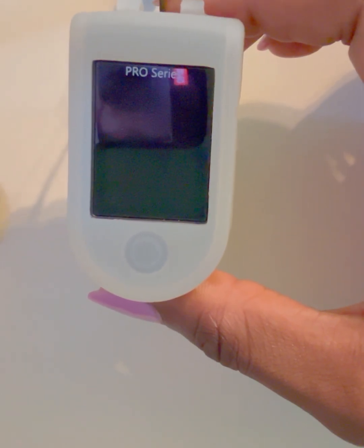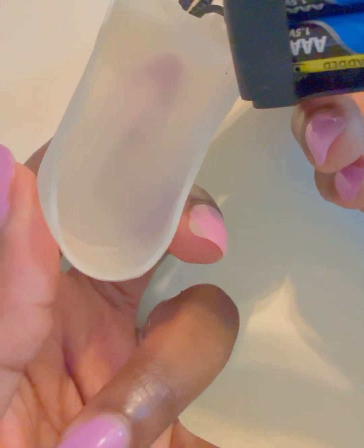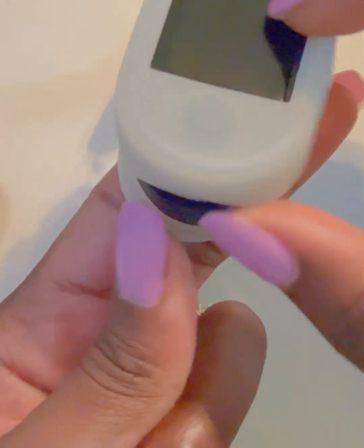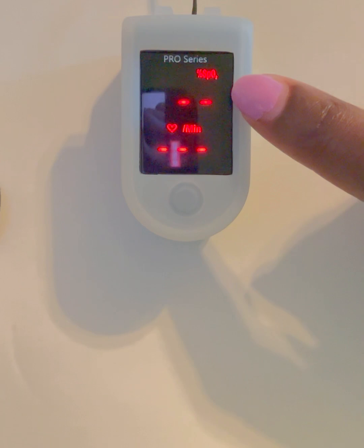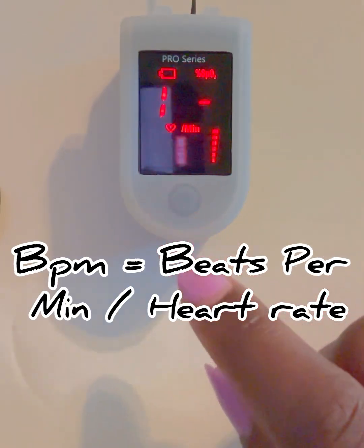So how do you use it correctly? First, you want to ensure that you have two AAA batteries — this one I purchased online and that is what it requires — and you just insert them into the back of the device. Turn it on, and you'll see two numbers on the display: your SpO2 at the top, and your heart rate, which may say BPM, at the bottom.